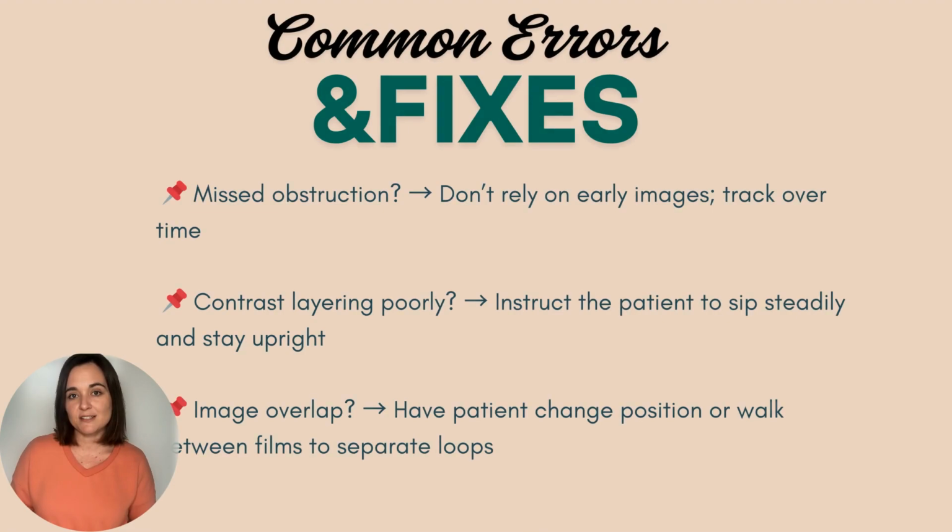Common errors and fixes. Missed obstruction. Don't rely on early images. Track it over time. Contrast layering poorly. Instruct the patient to sip steadily and stay upright. Image overlap. Have the patient change position or walk between films to separate loops.